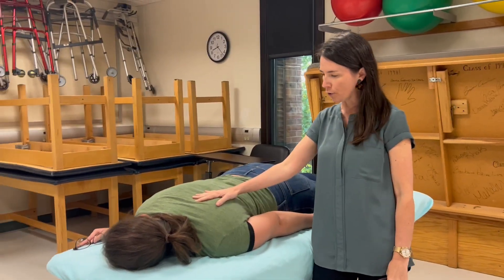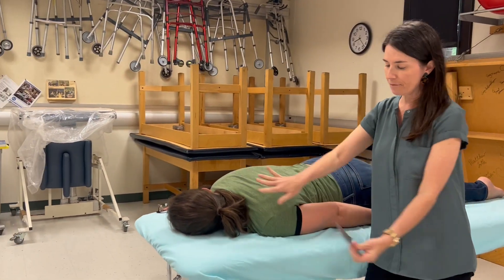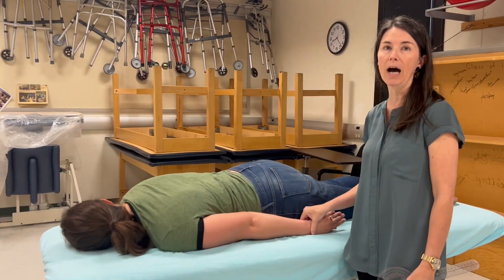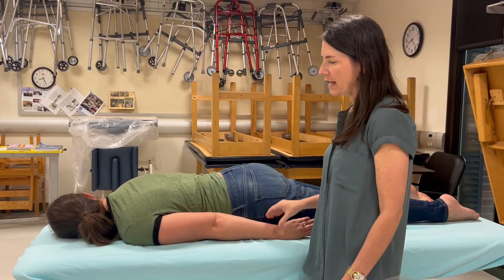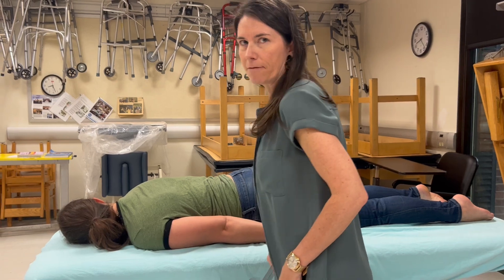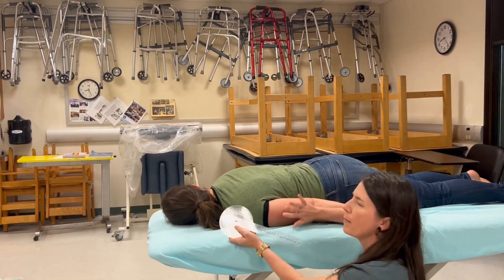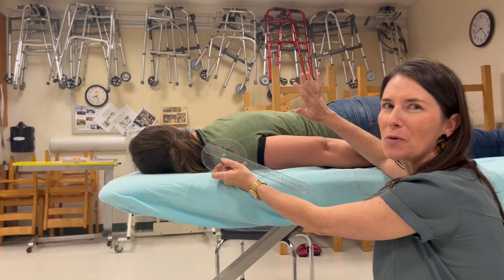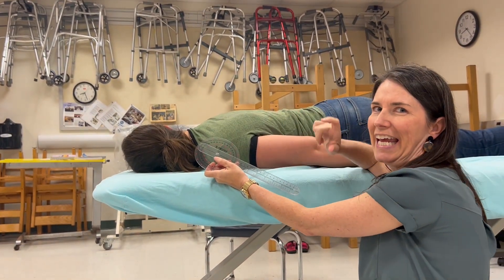Patient position is prone. She's facing away from the test side and her palm is facing her body for goniometry. It is difficult for people to bring their arm up into shoulder extension and hold it there for a long time, so we do our best to get in and get out.